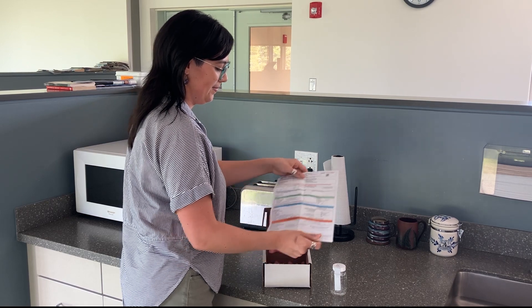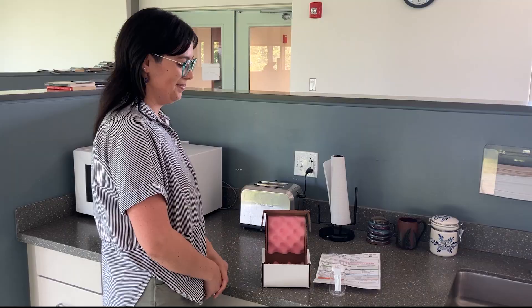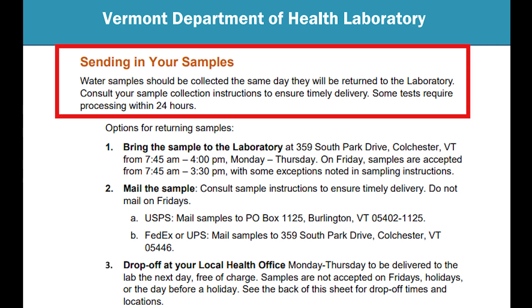Please keep the cardboard box the kit came in so you can use it to return your sample to the lab. Before collecting your sample, read the return instructions carefully to make sure you can drop off or return your sample the same day you collect it.